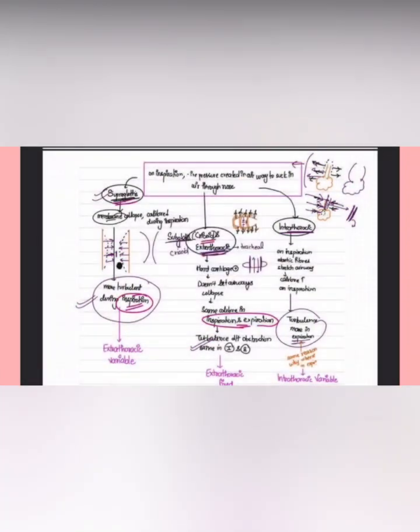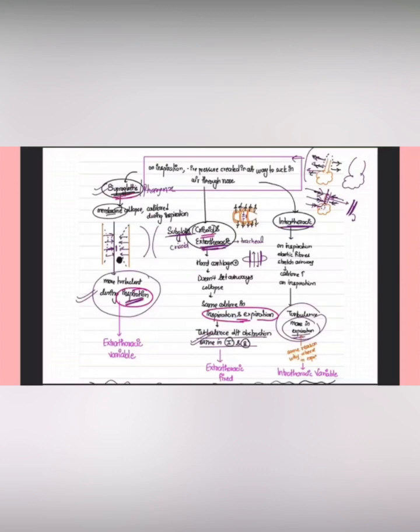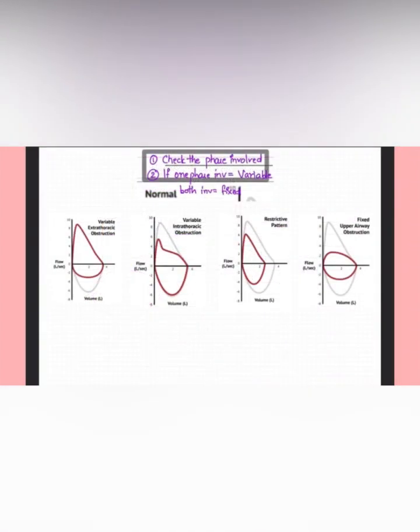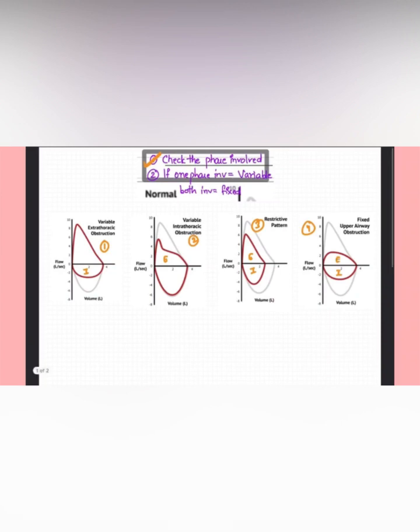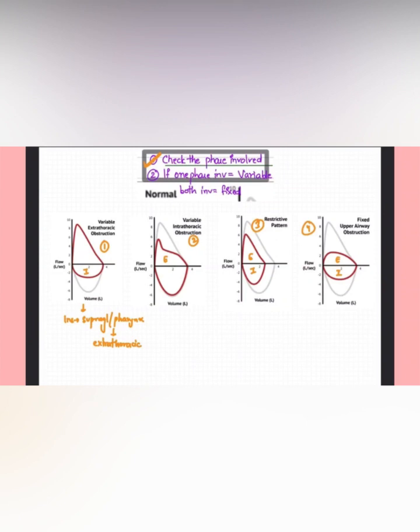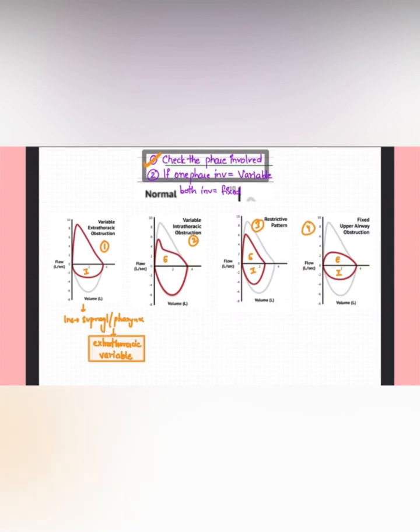Now interpreting each flow-volume curve: the first step is always to check which phase is involved. In the first curve, the inspiratory phase is involved. We know the inspiratory phase is affected in supraglottis and pharynx, both of which are extrathoracic. Since obstruction is present on inspiration only and not on expiration, it is called a variable type of obstruction. This loop with affected inspiratory phase is found in extrathoracic variable obstruction.